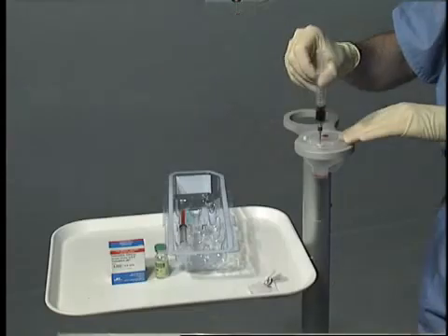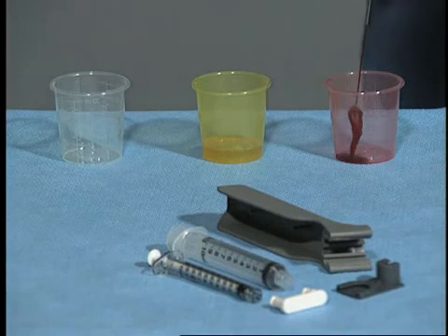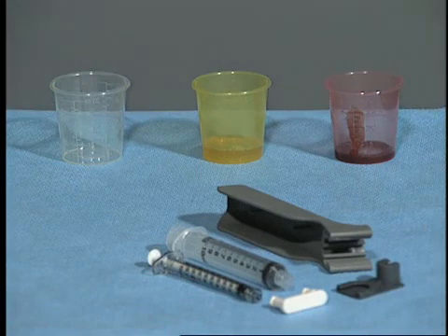Using proper OR protocol, transfer the recovered APC plus into the red cup located on the surgical field. Avoid excessive force when transferring the APC plus.